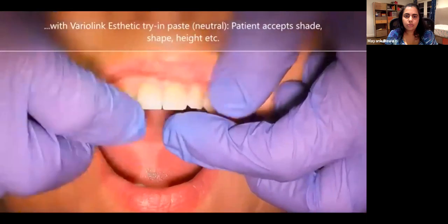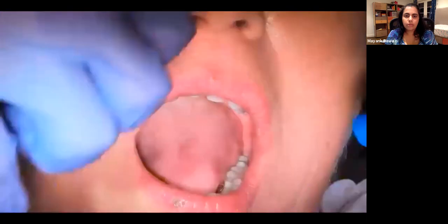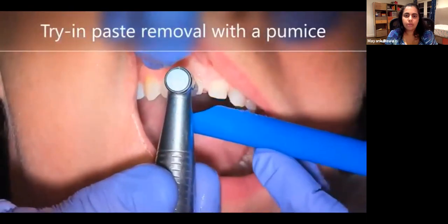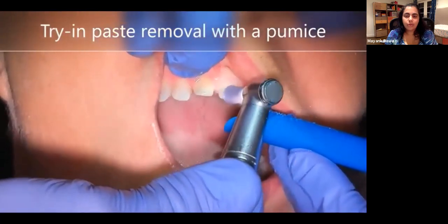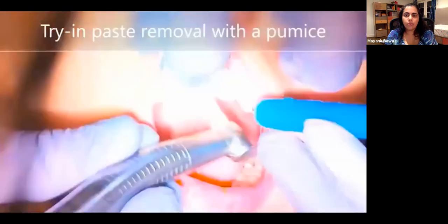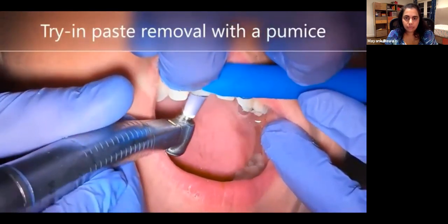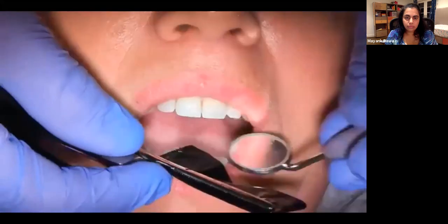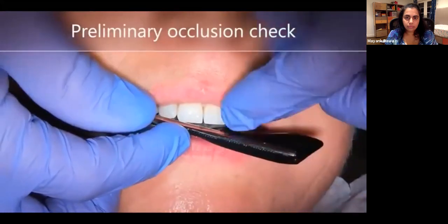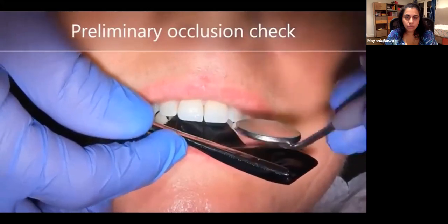So if you can see, when it was tried in, it looked like there was a small gap between the two teeth, but now it isn't visible. For some reason, they forgot to floss the contacts, but that's also important. Checking occlusion.